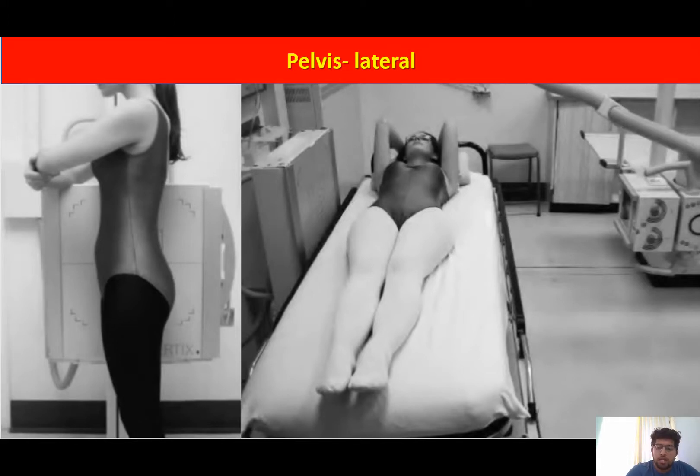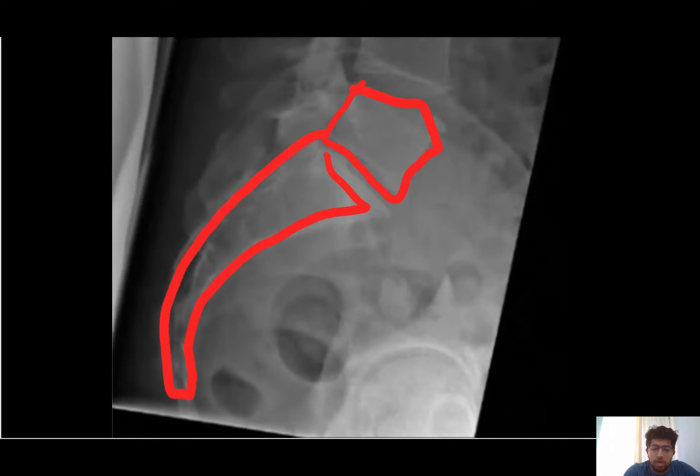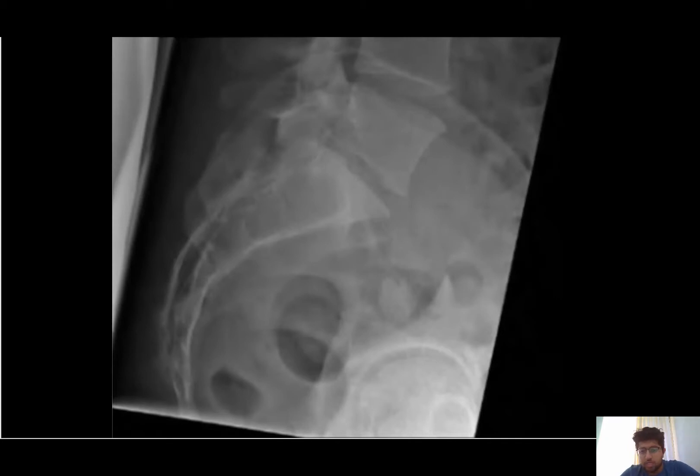The X-ray tube is centered just above the greater trochanter. This is how we obtain the lateral X-ray of the pelvis. In the image, we can see the lumbar vertebral body, the L5 vertebral body, and the sacral vertebral bodies. At the lowermost region, the coccygeal vertebral bodies are visible. Sometimes the spine and even the pubic symphysis can be seen in the lateral X-ray of the pelvis.